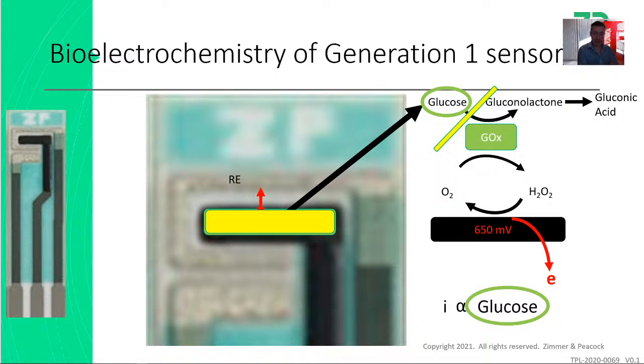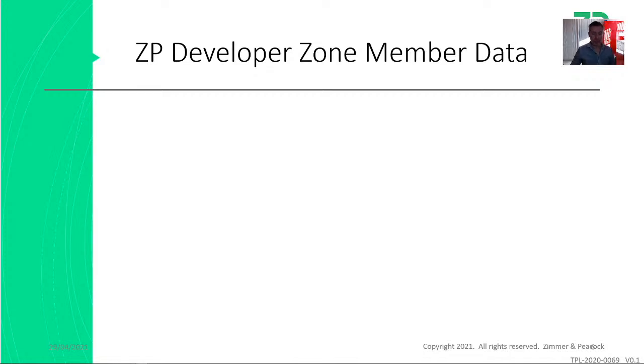So what the barrier layer does is it blocks the glucose slightly, whilst allowing the oxygen to still travel. That means you actually lose signal because you're blocking glucose, but what it means is you get greater linear range. We started to talk about barrier layers last week, and now it's become relevant again this week. So I'm going to use this again.